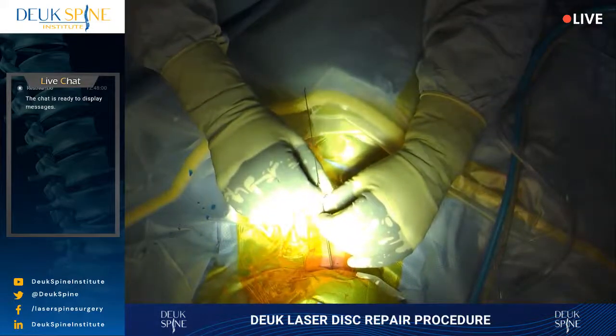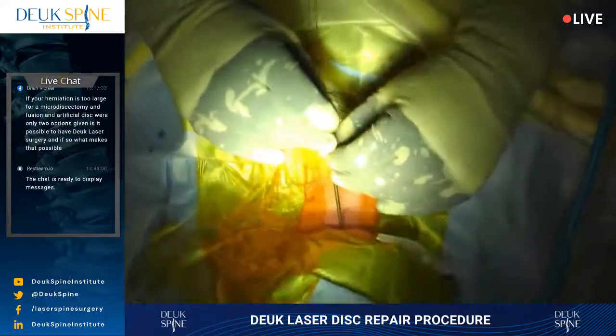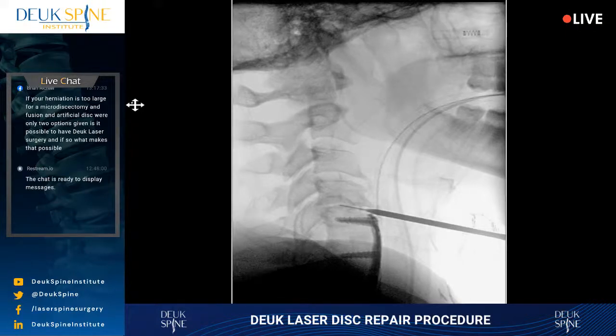All right, I'm now at the front of the C4-5 disc with the dilator, and I'm going to advance my dilator into the disc. I don't want to advance the guide wire, so I want to make sure the dilator is not pinching the guide wire. I can feel the bone spur that's in the front of the spine. We're not treating the bone spur in the front of the spine because it doesn't need to be treated.